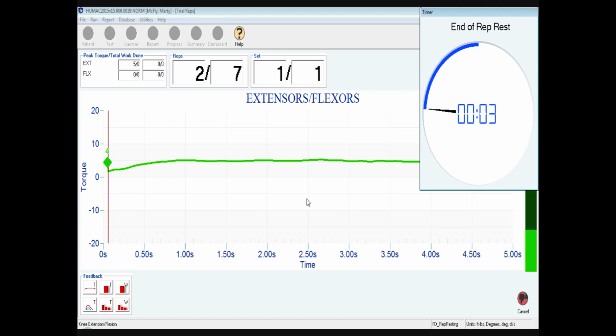But let's say they feel it a little. Let's say this, 25 was good. They get to 50% and they say, oh, I feel it a little. This doesn't hurt, but I like to say under 4 out of 10. If it's right there, that's okay. I'm all right with that. If it's above that 3 to 4 out of 10 threshold, they need to hold it back a little bit. So let's say 50% felt fine, they get to 75%. That doesn't feel good. It's above 4 out of 10. I tell them for your test, you're gonna stay below that pain threshold. All right. So after each of those warm-up reps, you're assessing how they're doing it.